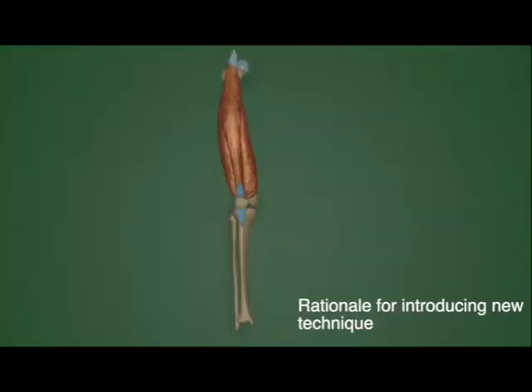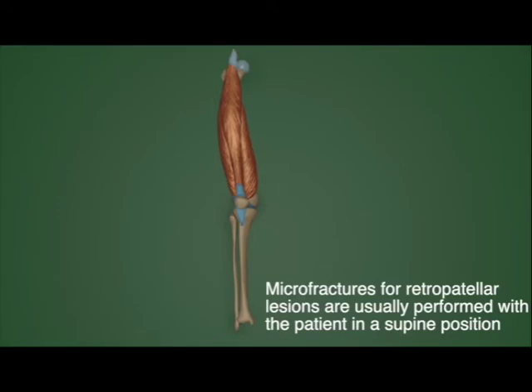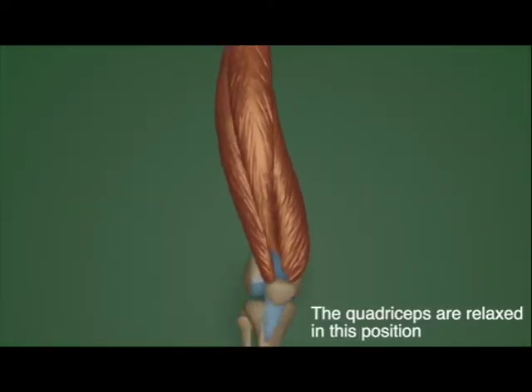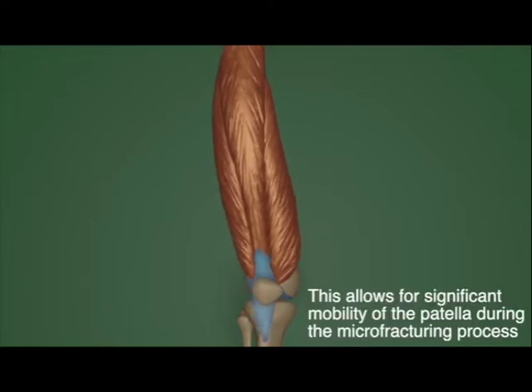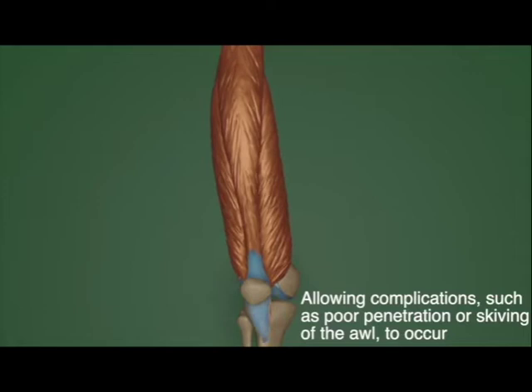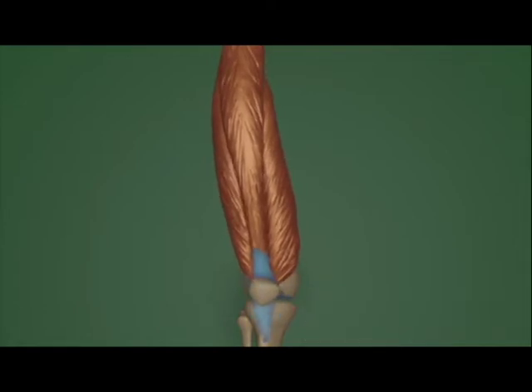A major obstacle in the use of micro fractures for the patella is the mobility of the patella. When the patient is in a supine position during surgery, the quadricep muscles are relaxed and allow the patella to move freely. This makes the micro fracturing process challenging, as a large amount of force must be applied through the awl to create the micro fracture holes, which can cause the patella to move even more.